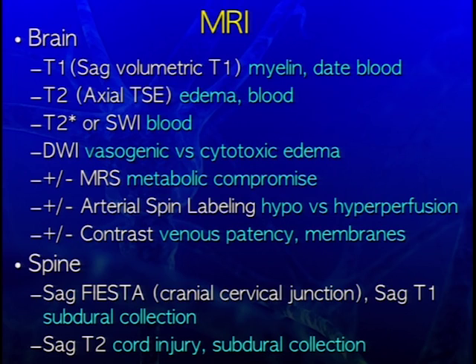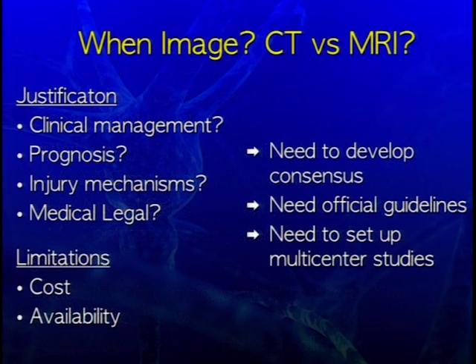But as Michelle suggested, it can be very difficult because these are kids who are in the ICU, and the ICU physicians' primary concern is stabilizing the child. Our primary concern is answering the question, to a certain extent. So we have slightly different points of view in terms of what we're trying to push, and especially understanding how to best treat them going forward. Having the sagittal T1 and T2, while there's blood products there, is very helpful because on follow-up, they may disappear.